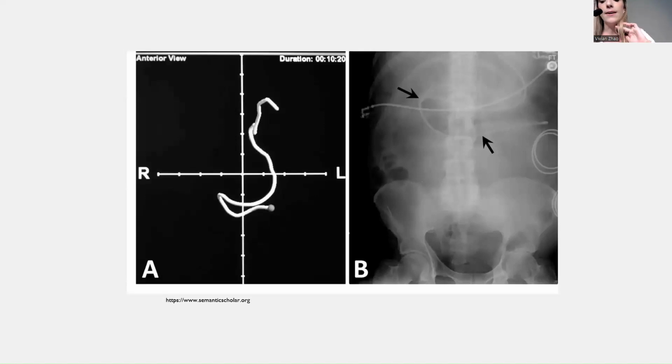So this is via electromagnetic placement device. So these are actually the same picture kind of. So this is what you would see on a device at the bedside. So this is if the patient is having it placed at the bedside without getting confirmation or needing confirmation from an X-ray. So on the left, this is what it looks like on the placement device. So you always want it to be below the center of the axis. If it's above that middle line, then it would be in the lung. Or if it's above, I don't know if it's above or below. And then to the right, you can see that it kind of takes the same trajectory, goes up a little bit, then goes back down and crosses again.